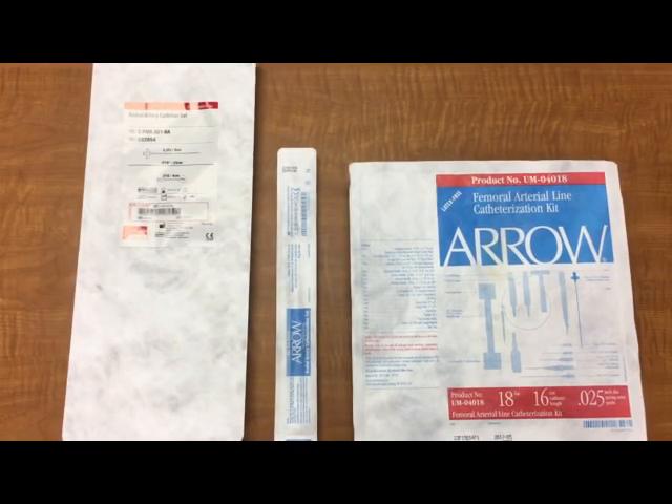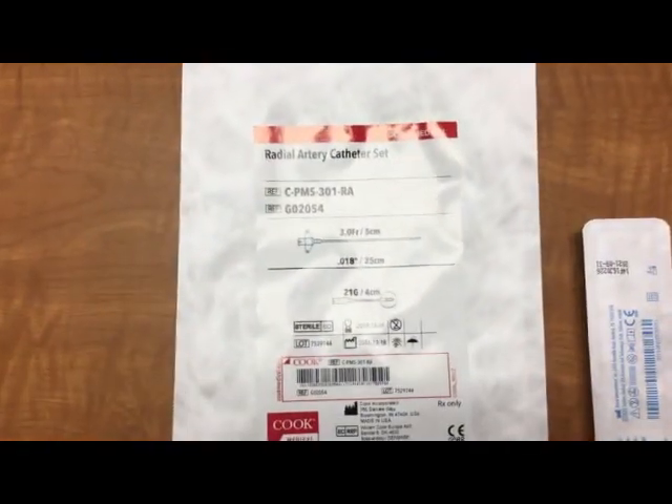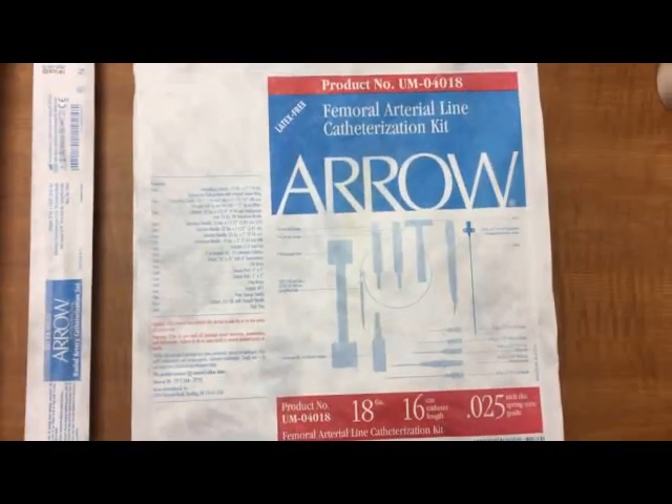When assisting with arterial line insertion, ask the provider which line they would like to place. For the radial artery, we have two options: the Cook Medical Kit and the Arrow Kit. For the femoral arterial line, we have an Arrow Kit.